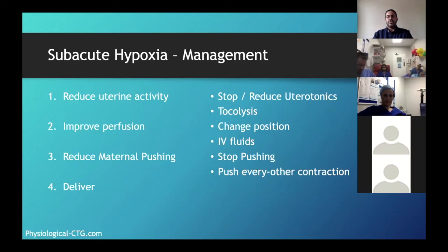Okay? During acute hypoxia, during subacute hypoxia, there is no such thing as cycling. Nobody will ever fall asleep during any of this event. If baby goes flat, this is the baby blacking out. This is fainting. Yeah? This is brain hypoxia. Does that make sense?